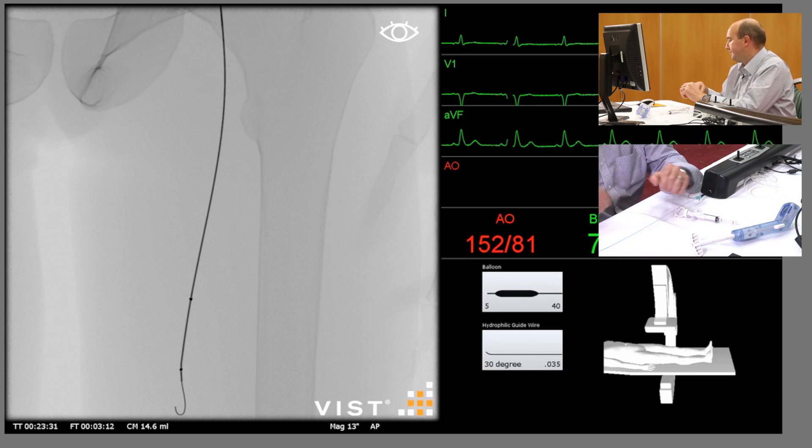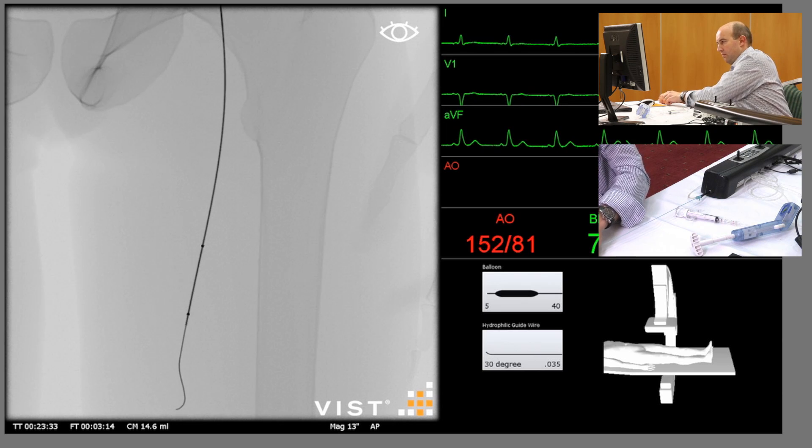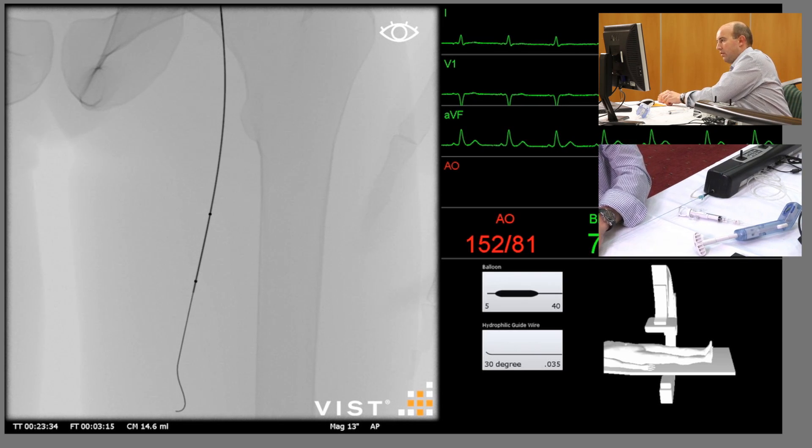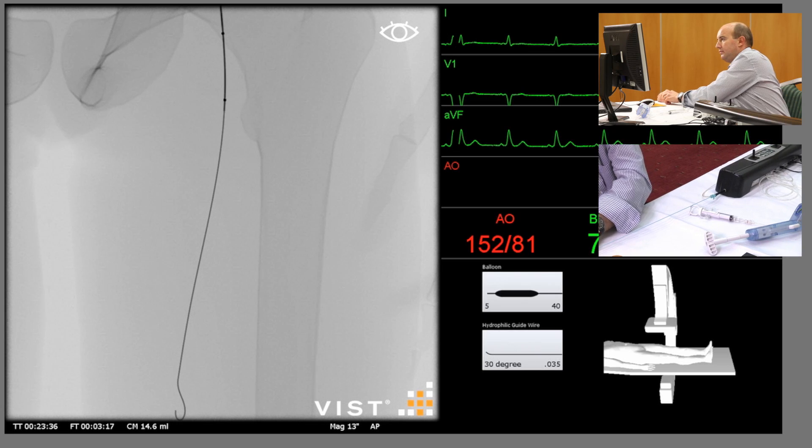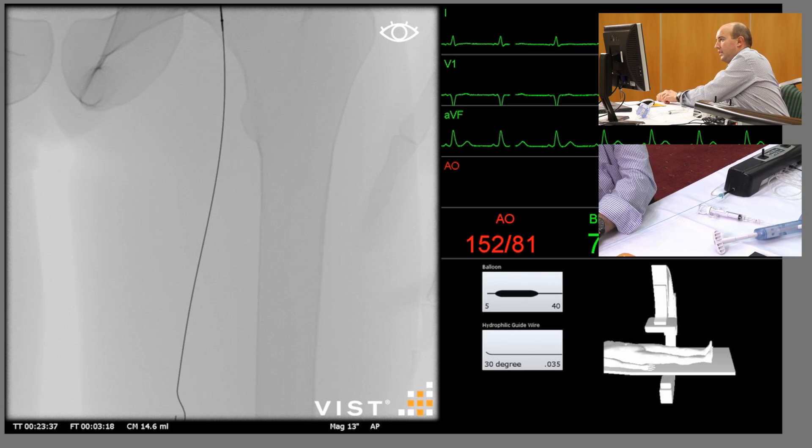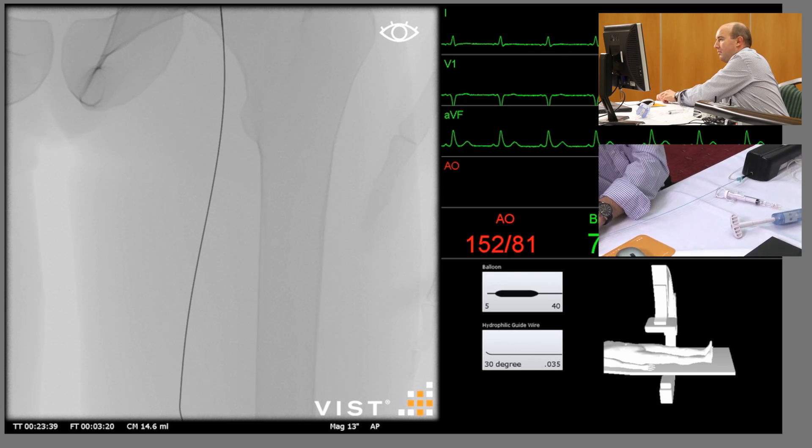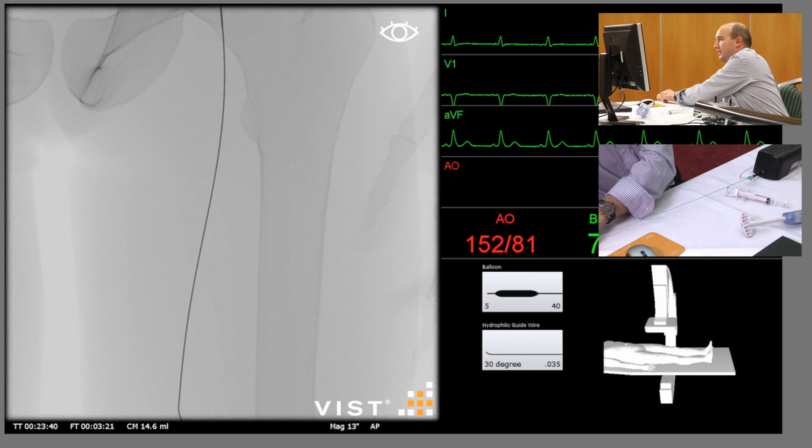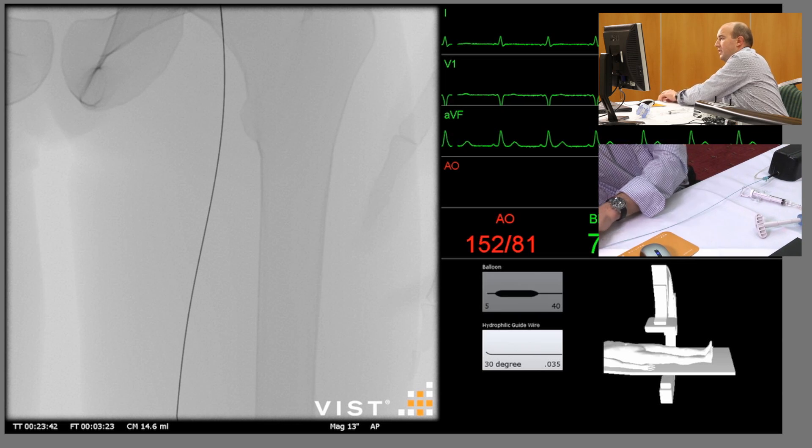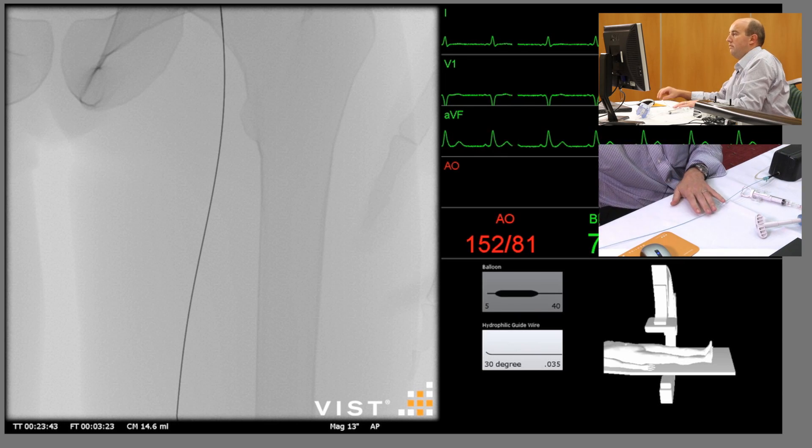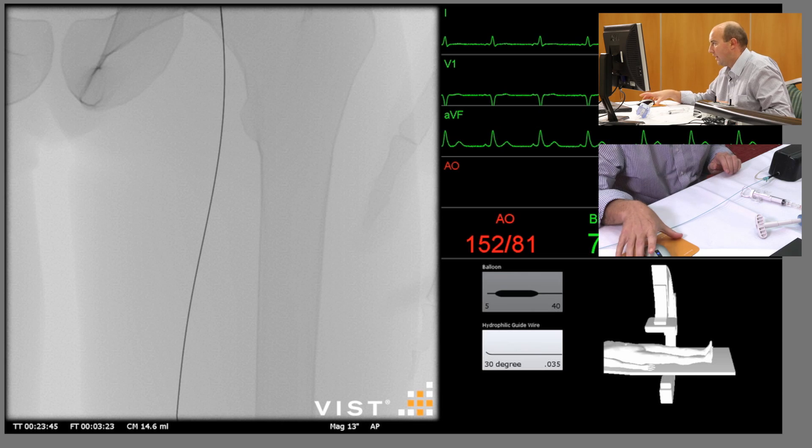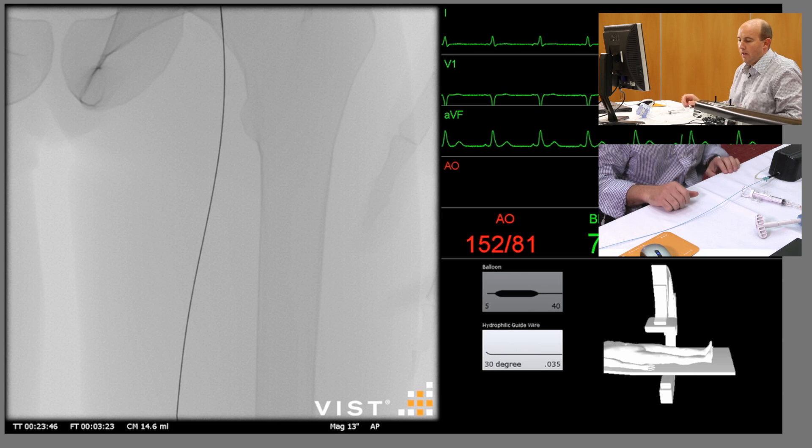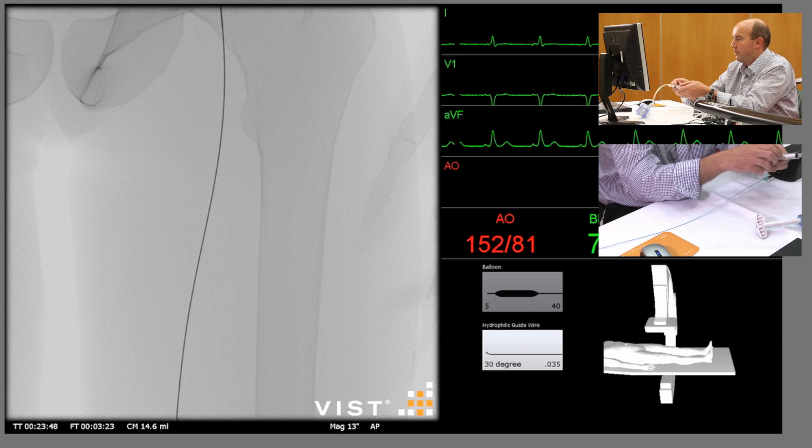Okay, check your balloon's deflated before you withdraw it. Keep the wire across the lesion and take the balloon out and disengage from the system, which it is there where the light fades.